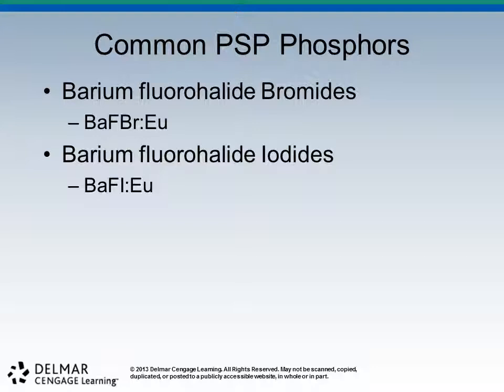I hate to call it a gelatin, but they're not liquid at all. That's just something you've got to know when you move forward, because DR works with different types of chemicals. You do need to remember these terms, and probably if you just remember europium activated barium fluorohalide, you're good.